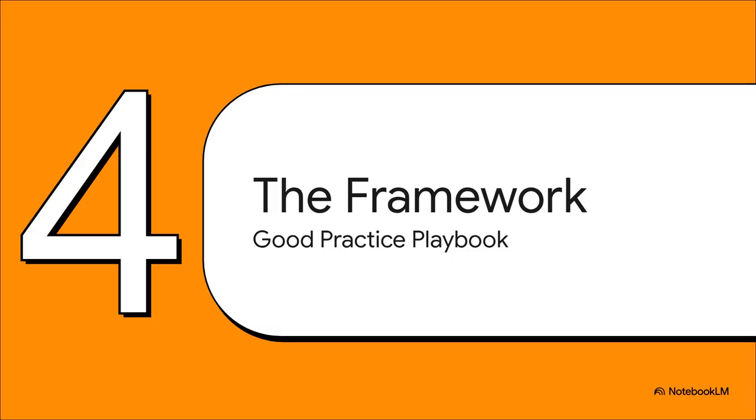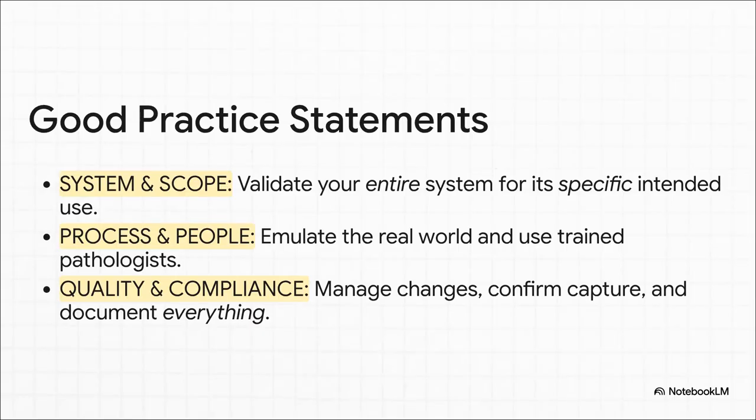All right, so beyond those 3 big, strong recommendations, the guideline also gives us 9 good practice statements. You should think of these less like hard and fast rules and more like an essential playbook for running a really smooth and successful validation. The easiest way to think about these statements is to group them into three logical buckets.